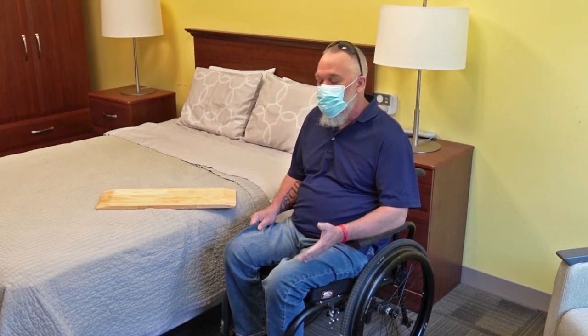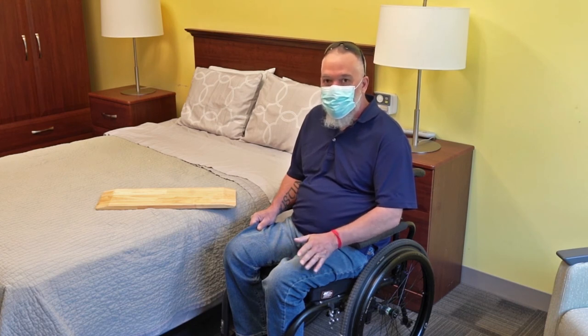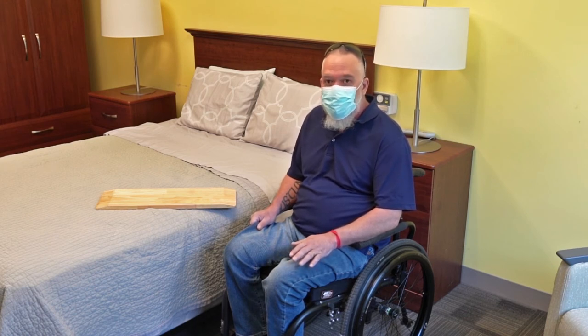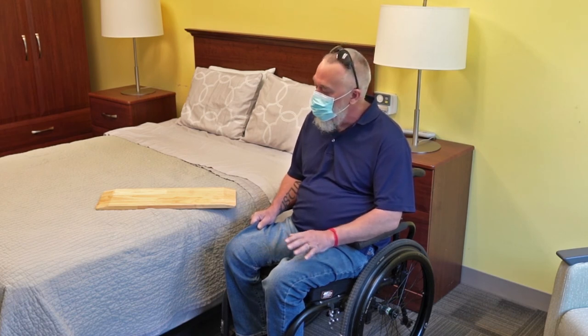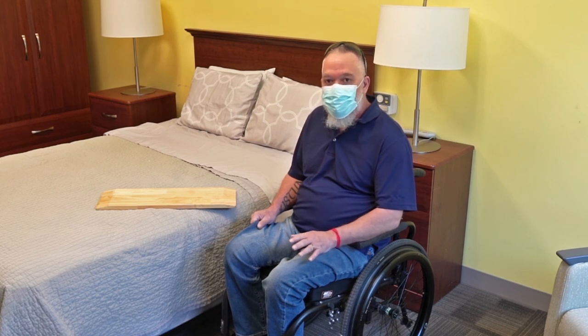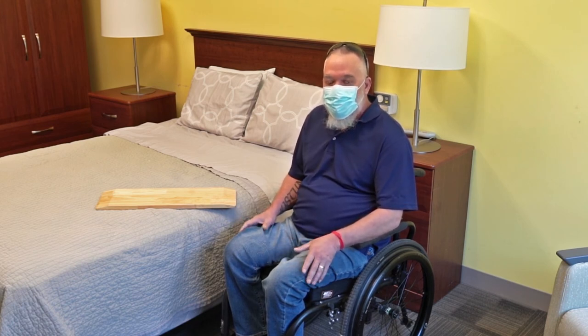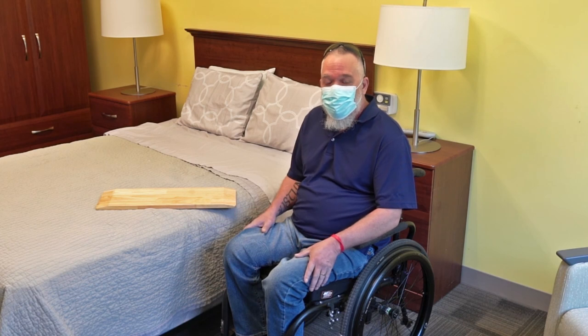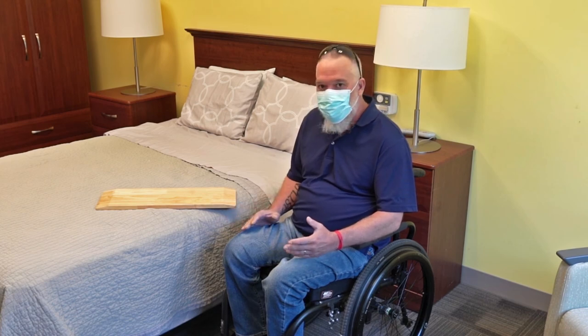Now what we just showed you was the transfer to the bed. There are many transfers you're going to have to accomplish — transfers to your vehicle, your commode, your shower chair, your couch, whatever you're going to be sitting on — and all of them have a little bit different movements and nuances. Those are things you're going to have to learn on your own: the best way for your body to move. It won't take very long. The key things you'll need to learn are body positioning, foot positioning, and board position relative to wherever you're transferring to.